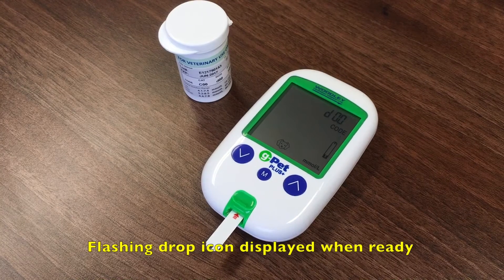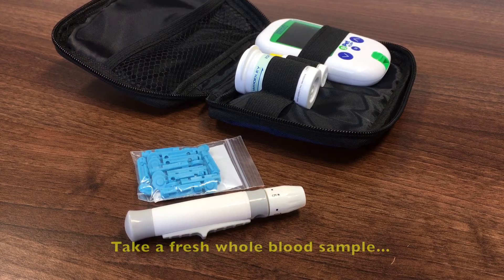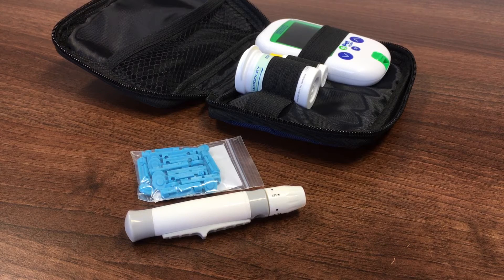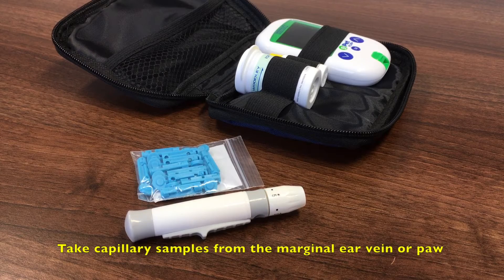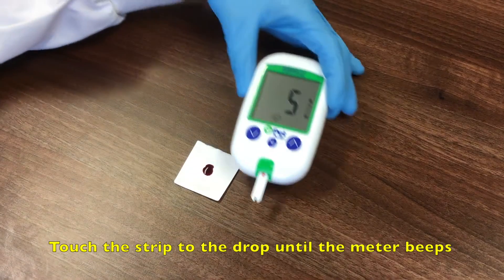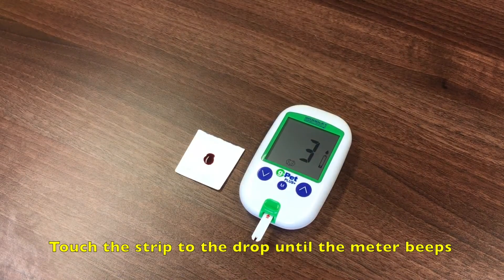The GPET Plus will display a flashing drop icon when ready to test a sample. Take a fresh whole blood sample using an insulin syringe or the lancet provided. Take capillary samples from the marginal ear vein or from the paw. Discard the first drop of blood and touch the tip of the test strip to the fresh drop of blood until the meter beeps.